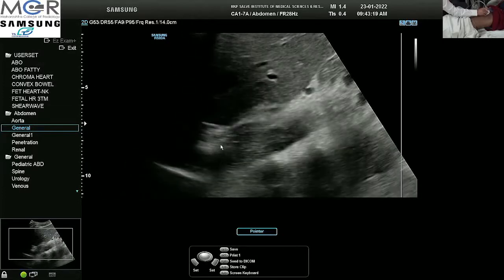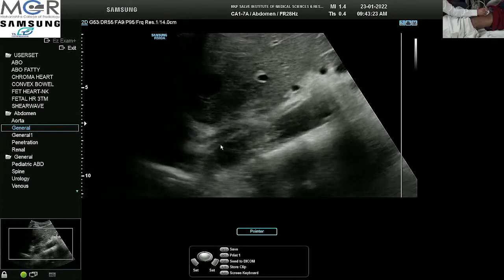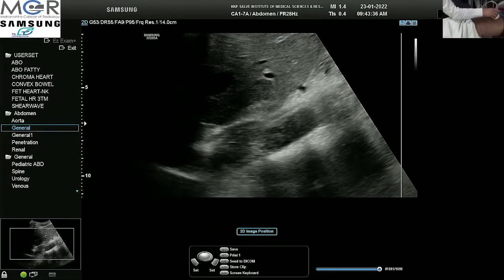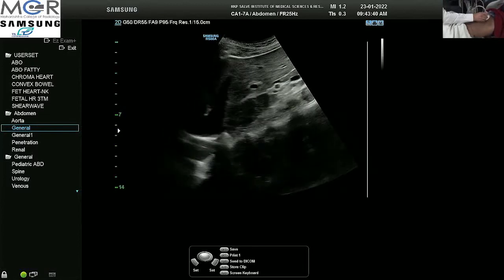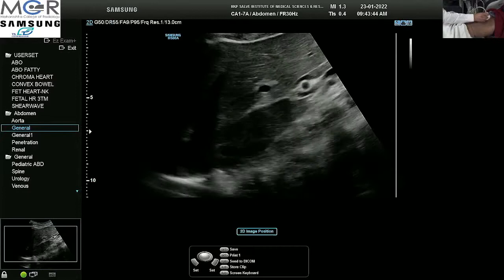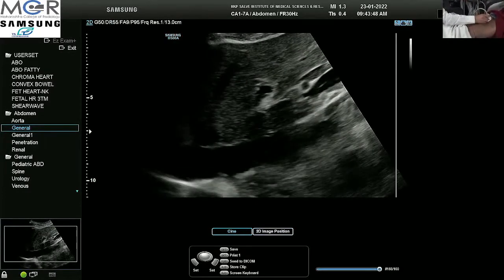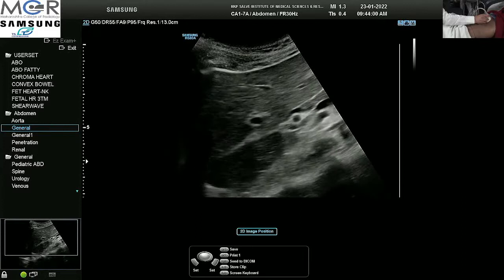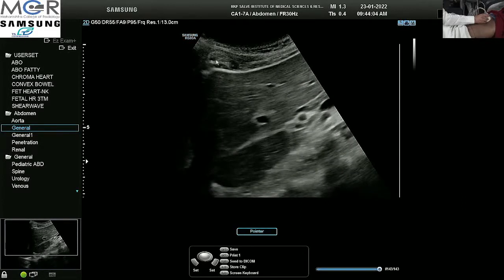With the convex probe I am not able to see the five layers of the gastric wall or the gut signature as described by Dr. Onkar sir. This view is also important for seeing free air in the peritoneum, which can be seen in cases of perforation. The air is seen overlying the left lobe of the liver — so this is a very good view showing the presence of free air within the peritoneal cavity. It also tells us about the caudate lobe of the liver and the relative sizes of the left lobe and caudate lobe.